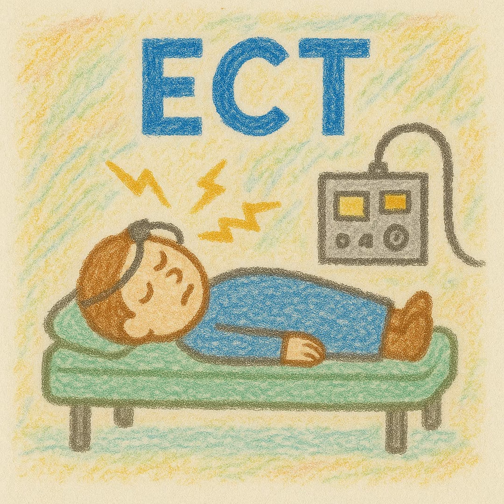See if you get a seizure at that next level. If you don't, you're going to try again and basically keep doing that up to say, 4 times until you get a seizure. So let's say they get a seizure at dose level 2. That might correspond to, say, 75 millicoulombs. And so your seizure threshold is 75 millicoulombs.